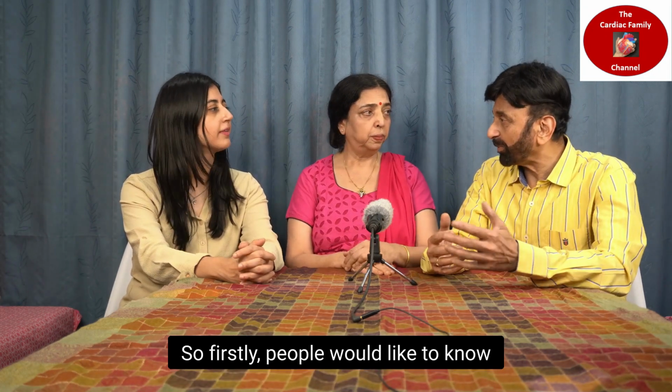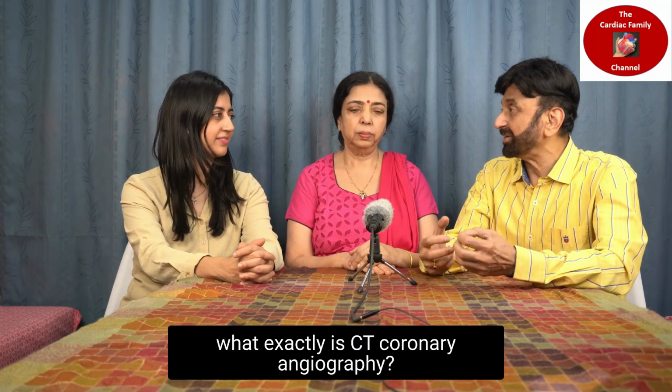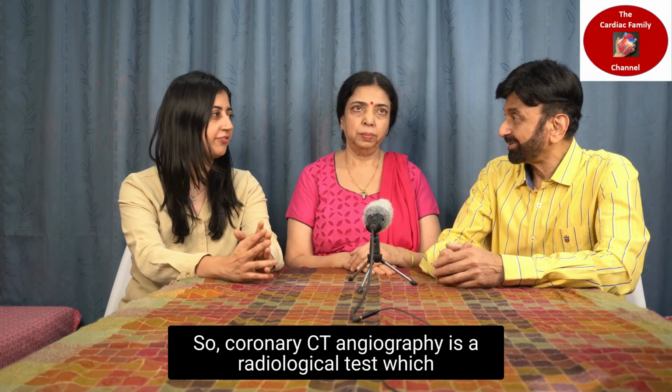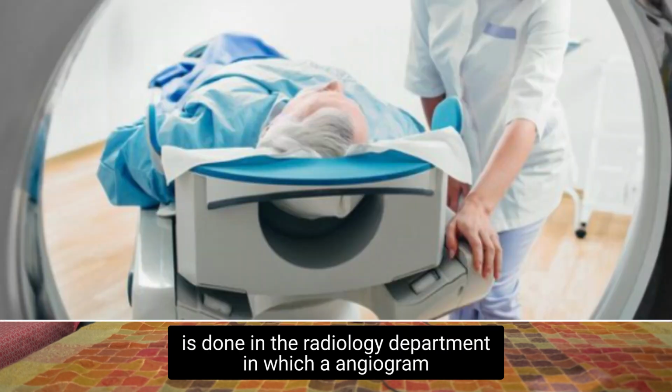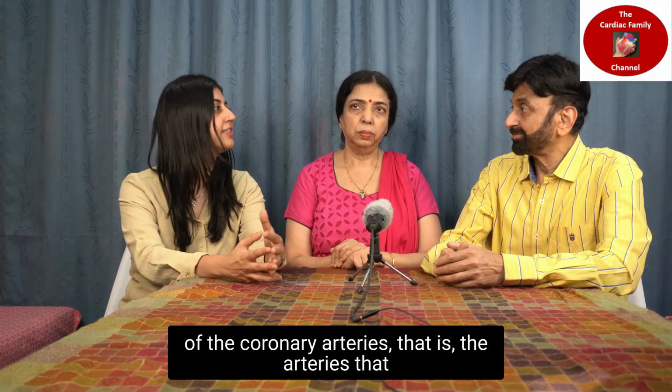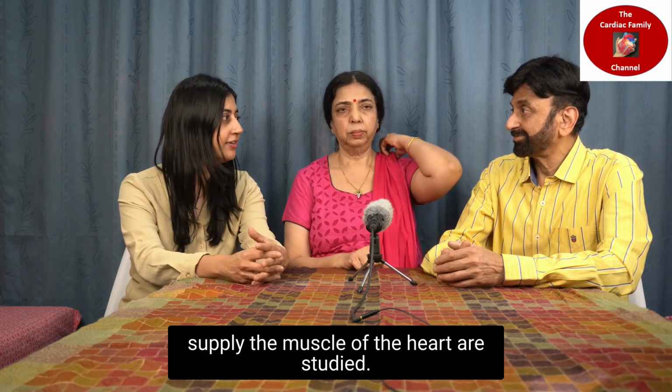So first, people would like to know what exactly is CT coronary angiography. So coronary CT angiography is a radiological test which is done in the radiology department, in which an angiogram of the arteries, that is the arteries that supply the muscle of the heart, are studied.